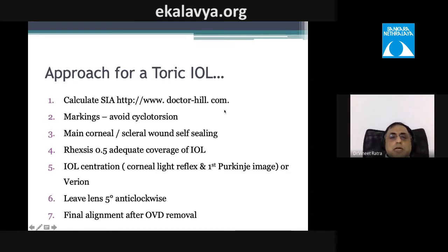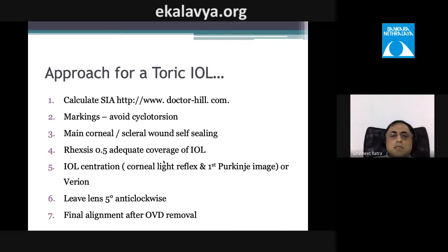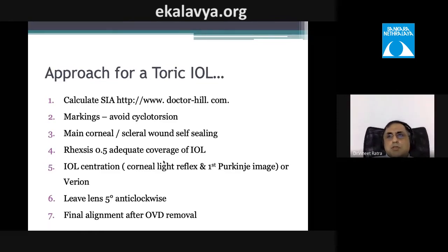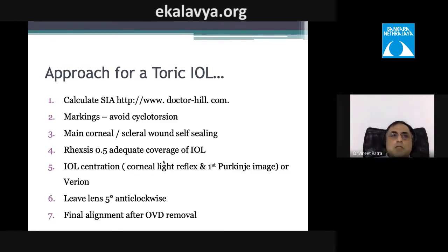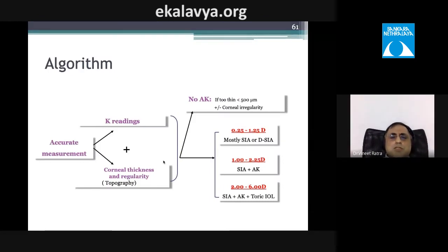When placing a toric IOL: calculate SIA, check cyclotorsion, assess both corneal and scleral wounds, and ensure capsulorhexis coverage of about 0.5 mm around the IOL — too small risks phimosis and lens movement, too large risks IOL decentration. Under-rotate by about 5–10 degrees initially, then perform final alignment after removing viscoelastic.